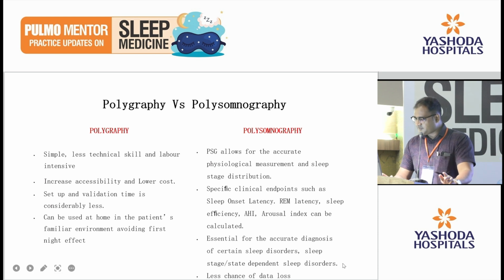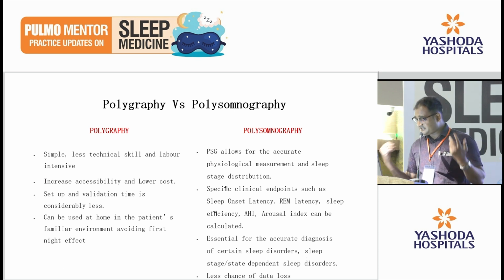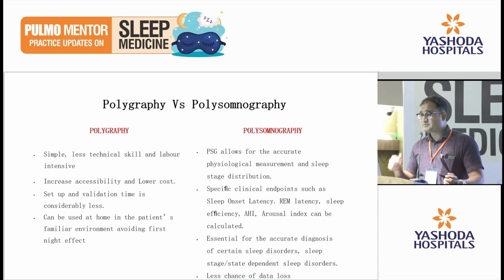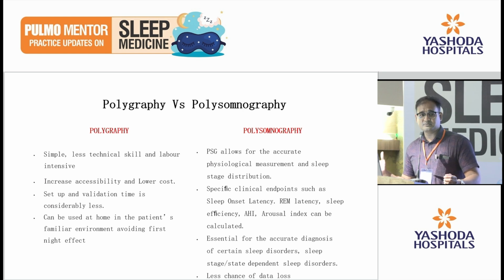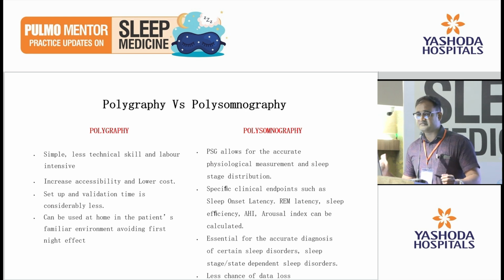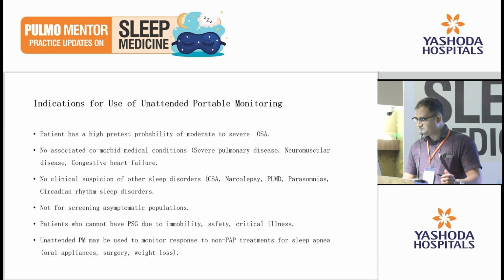It is essential for accurate diagnosis of certain sleep stage disorders and state dependent sleep disorders, and there is less chance of data loss. What I mean by data loss, as one attendant will be there in level 1 polysomnography, if something is happening, he can correct it. So there is less chance of data loss in polysomnography as compared to polygraphy.